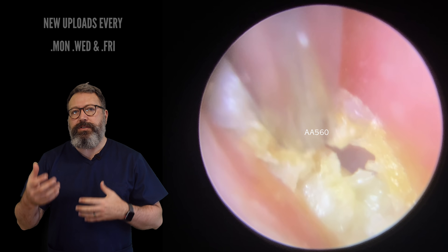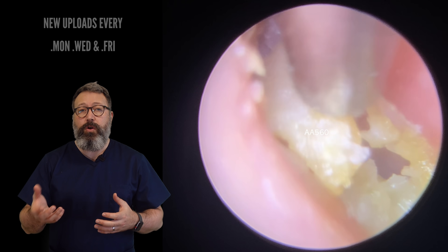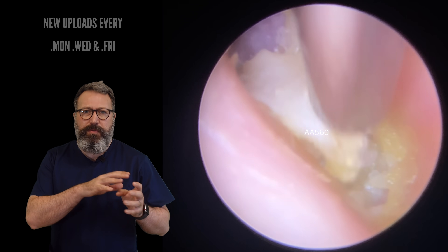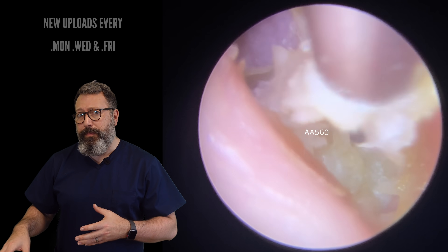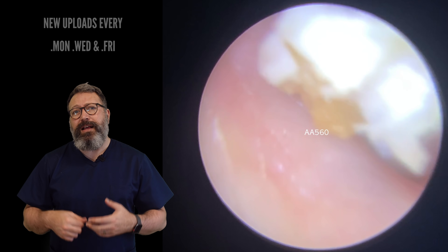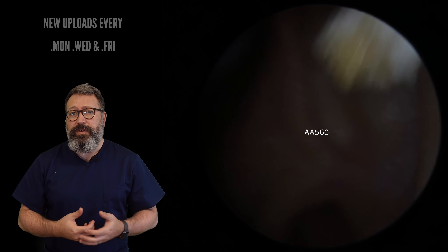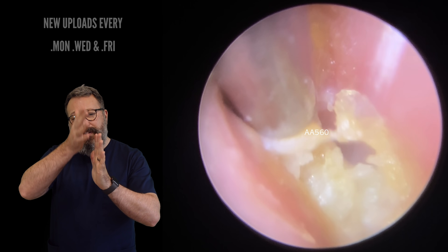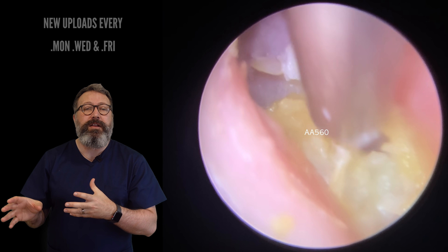Now what this is, is layer upon layer of skin. As we start to take this away, you will see where this is generated from. If you watched Monday night's video, we talked about this dead skin and how it migrates away from the eardrum down the ear canal — that's what should happen. Because of the different surgeries this patient's had, that skin migration process has become really interrupted, so instead of the skin migrating away from the eardrum, it forms layer upon layer on top of the drum and doesn't migrate particularly well down the canal.